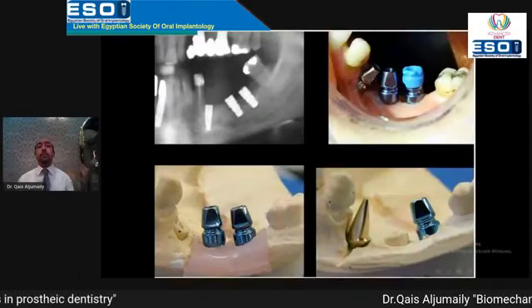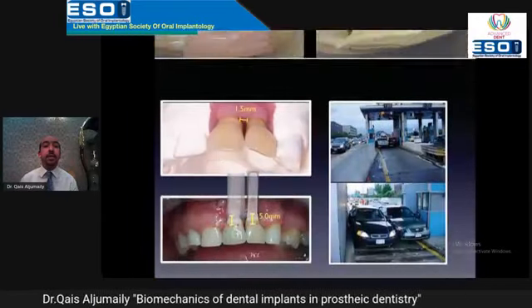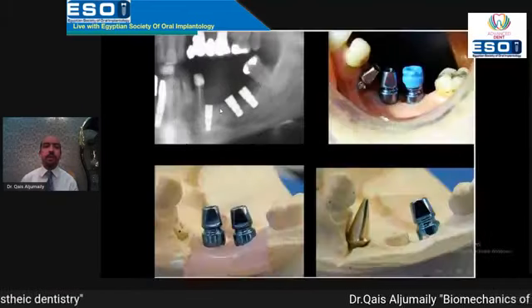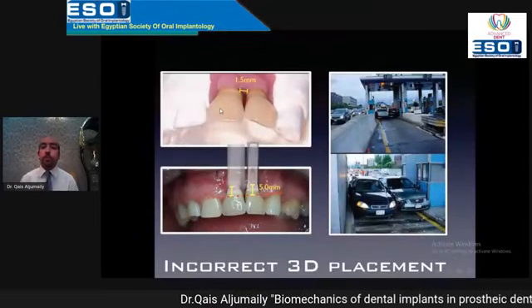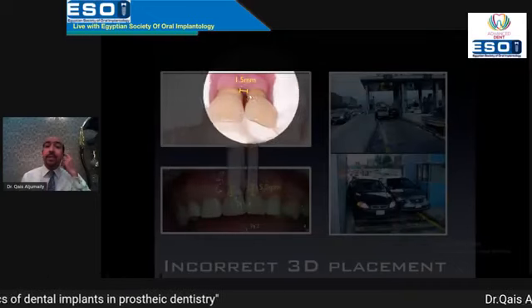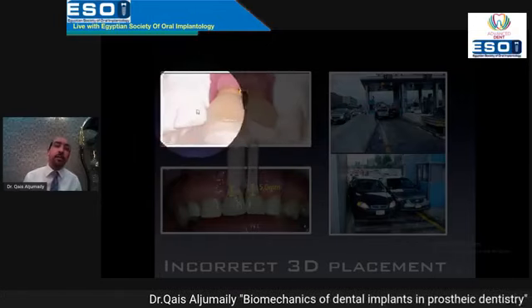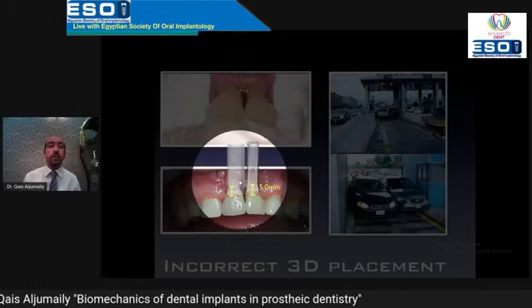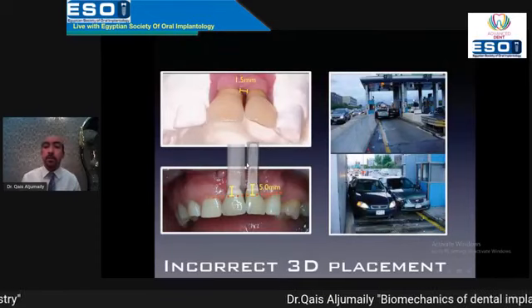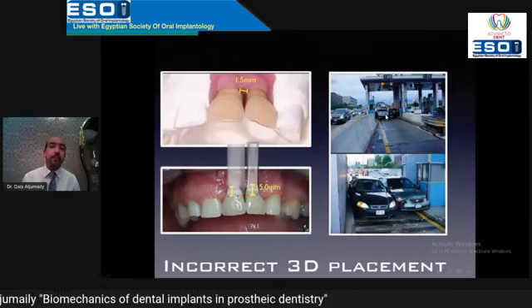So from the beginning, we have to think about the prosthesis, about the bridge, before inserting our fixtures, our dental implants, in such an ugly position. So avoid overcrowding of the dental implants here. It will affect the inter-implant papillae between the implants and between the implant and the adjacent tooth. As you see here, it's a crowding in the insertion. The distance between the two fixtures is less than 3 millimeters. So avoid the mesiodistal crowding of the fixtures.